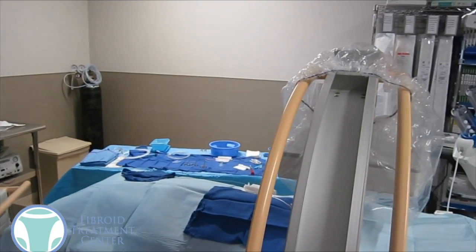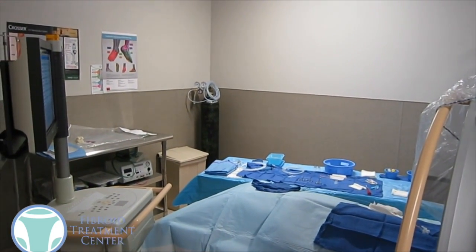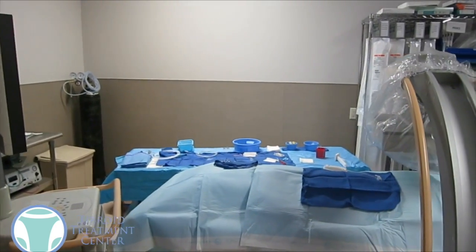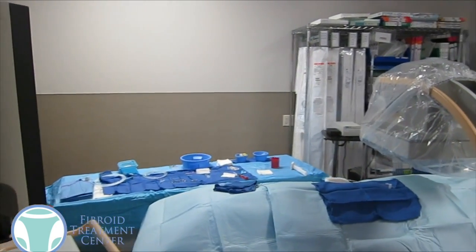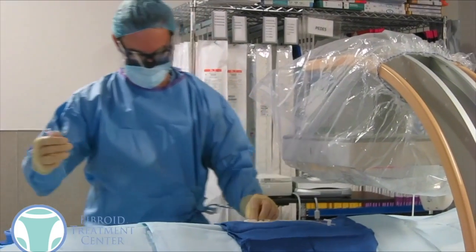A woman will have that x-ray machine over her pelvis area so that we can take x-rays of the arteries. There'll be some basic equipment on the back table as you can see there. One of our other videos goes into more details about the materials used and you can watch that.